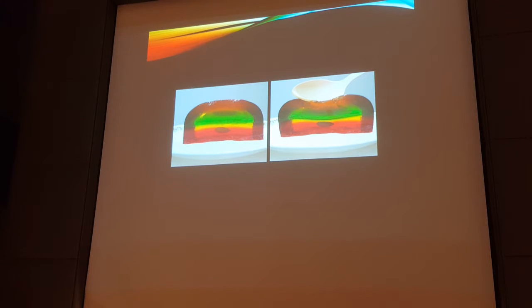All that strain is, is we've got jello with an almond, and when we apply our force with a spoon, the almond does not change shape, so it's stiff. The jello changes shape, so it's soft. This is all that the systems do. They look at the frame-to-frame differences of the tissues. If they do not change very much, you consider them stiff. If they change a lot, you consider them soft.